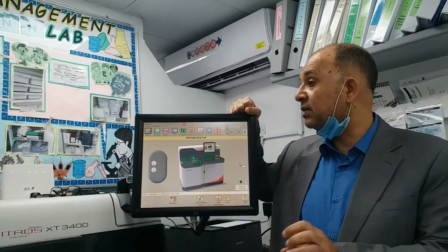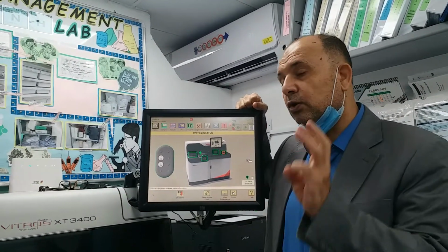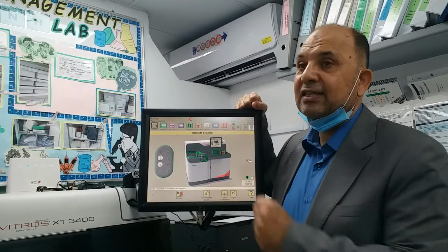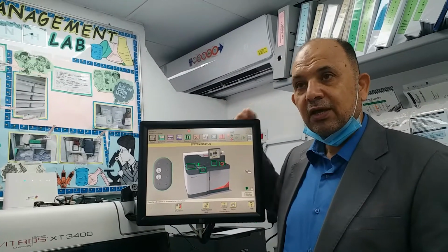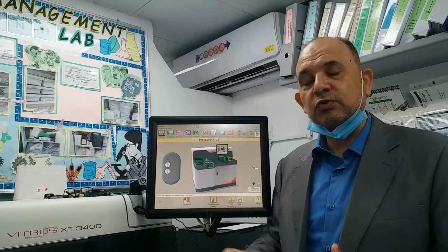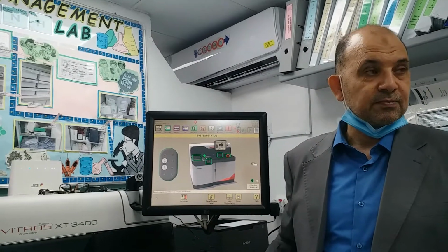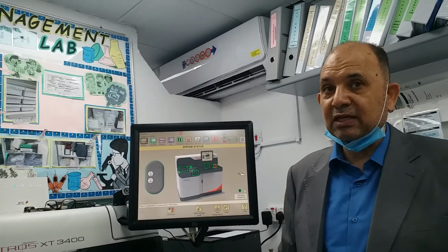Now, in case you receive any new reagent lot number or new calibrator lot number, you will find the data there on the system. Your old reagent will be identified. It will not be ignored or something like that. Okay, any question about the things which we finished?